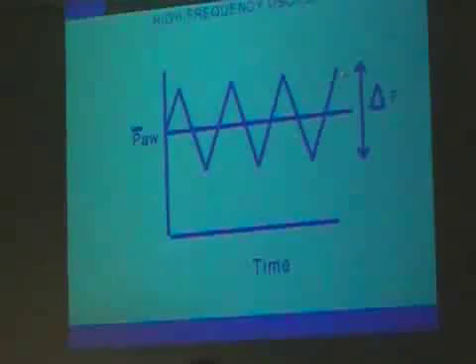Now, as you remember from mathematics, because it's above and below the mean, it cancels out, and the mean airway pressure is the same. However, you have to remember that if you're using very high tidal volumes, you are going to hit higher peaks. So one of the major points of proper use of oscillation is to minimize your tidal volume, because the whole point is to try to keep your tidal volume as low as you can and still get adequate ventilation. So we need to remember that. We need to remember that if we use very high tidal volumes, and it can be done, you're closer and closer to tidal ventilation and what you're trying to avoid for this particular baby.